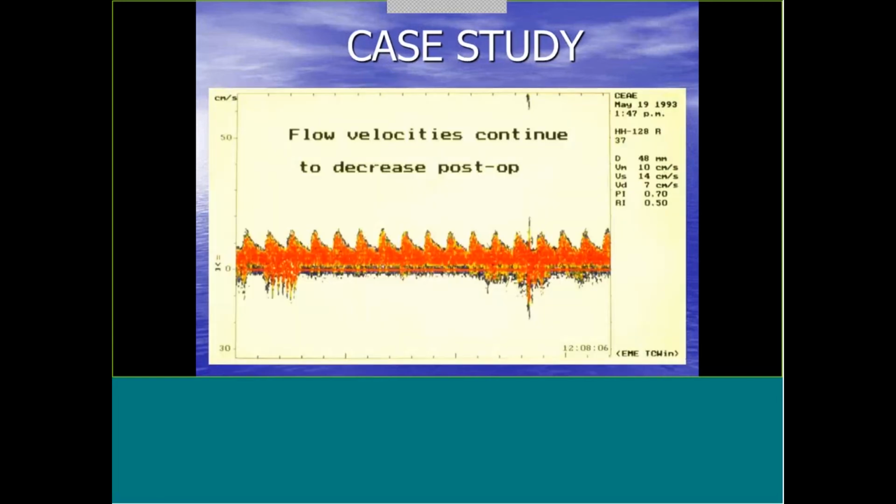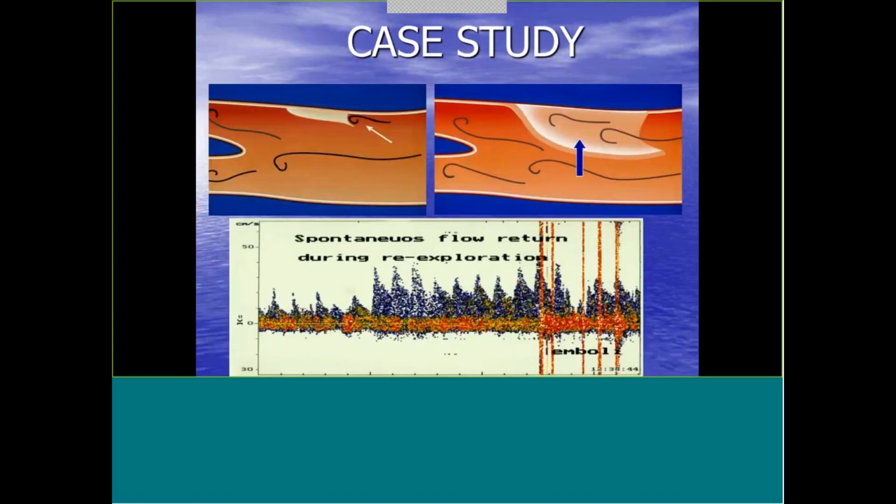And then all of a sudden, the velocities continued to drop, and I heard emboli. This is an embolus here, right here. This is an embolus. And emboli can occur post-procedure, trust me, but I started to get a little bit concerned when the anesthesiologist said, oh, his blood pressure is really increasing. So what was happening was, and you can see here, this is a really good example. So my flows were dropping, and then you see how all of a sudden they would increase, and then they would drop off again. I would hear emboli, and then they would increase again.